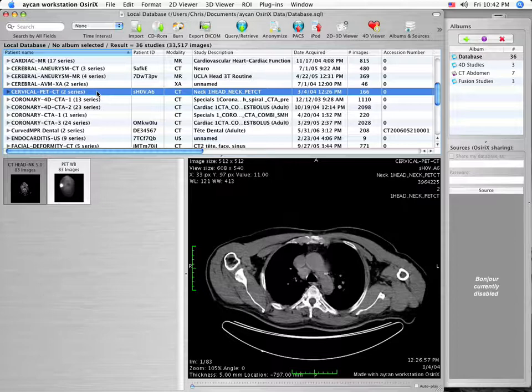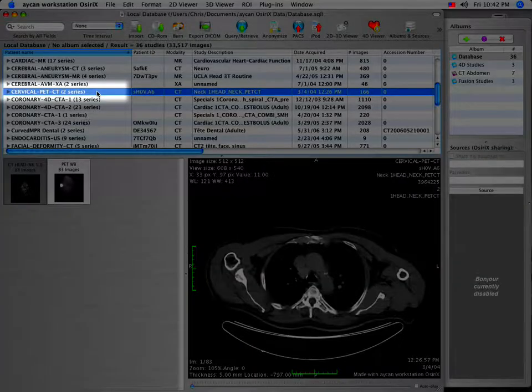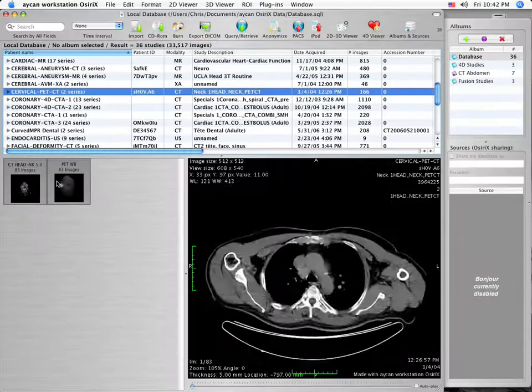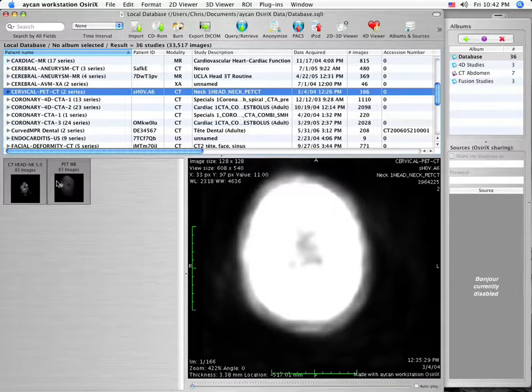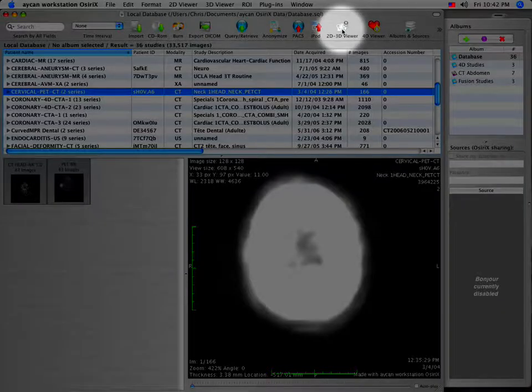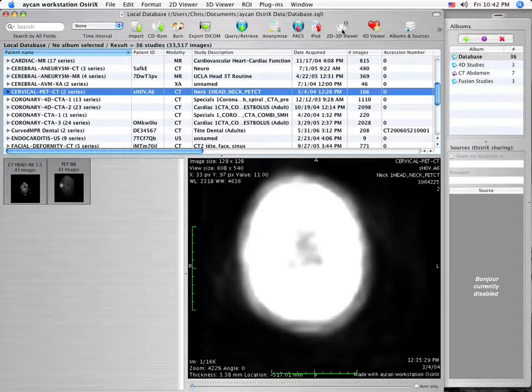From the database window, select the patient Cervical PET CT with a single left mouse click. Drag the mouse from the first to the second thumbnail series to highlight both series, and single left click on 2D, 3D Viewer.